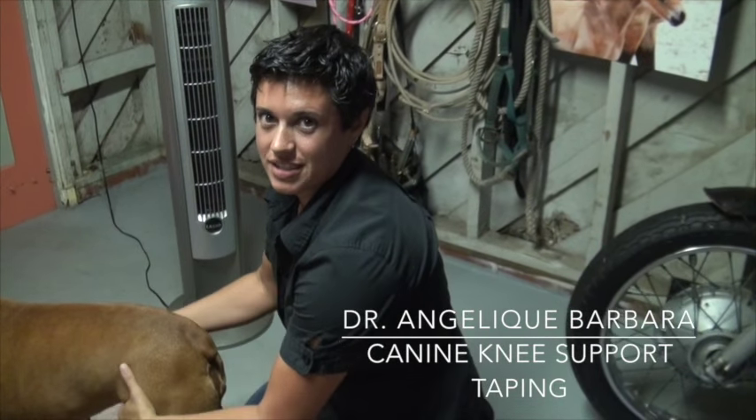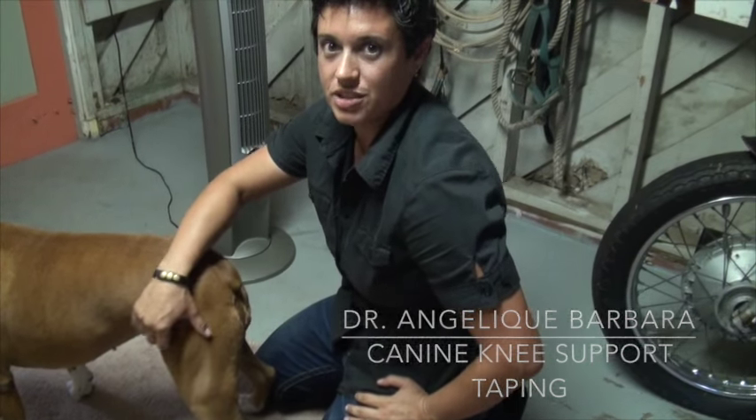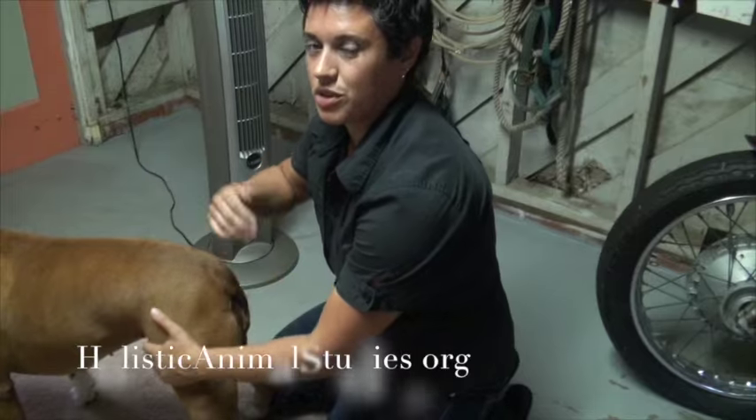Alright, so we're going to go through a knee taping on Lola. She's got a little bit of instability, probably in the ACL area, so we're just going to do a knee support taping to try to give her a little bit more support.